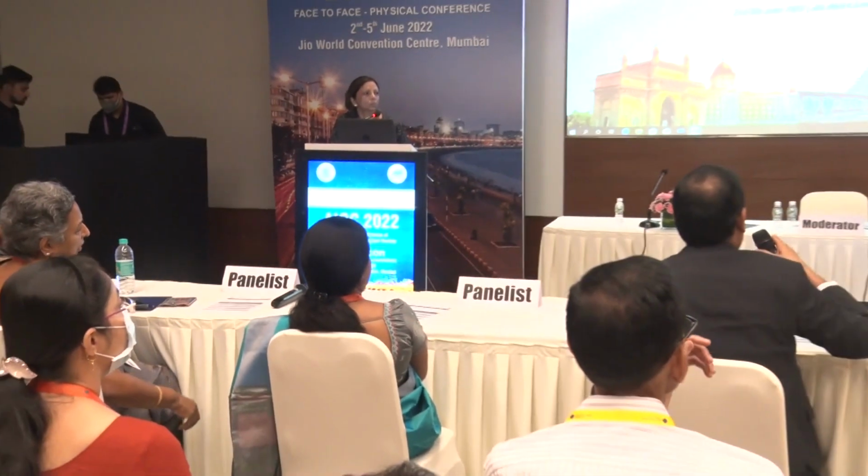So how often should the fundus disc photographs be taken? Is there any rule? Often, it is a must. For every visit? Not every visit. What does often mean, every 6 months or 1 year? Minimum is yearly once. If you suspect a change, take it again. Yeah, minimum I feel is yearly once.